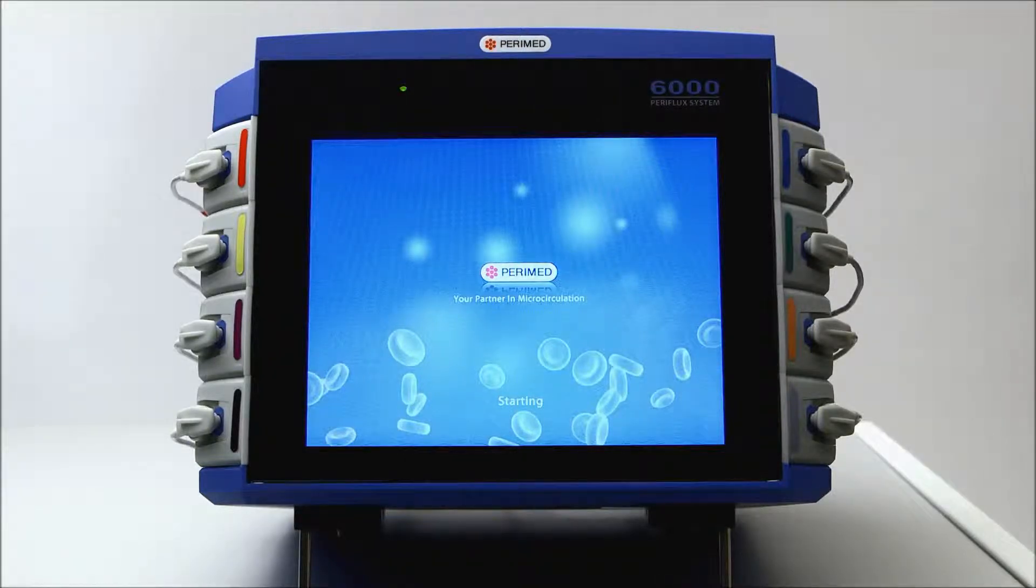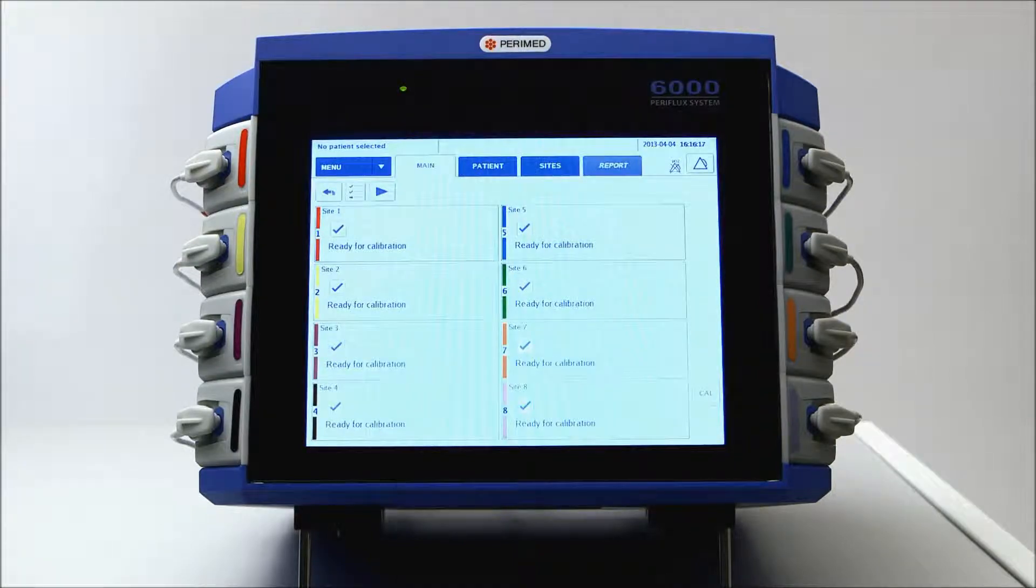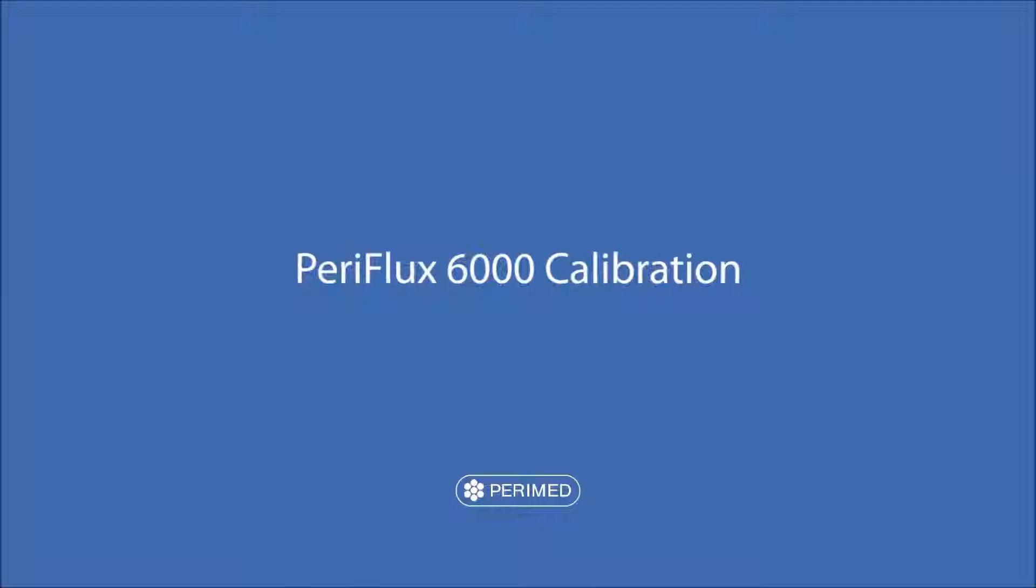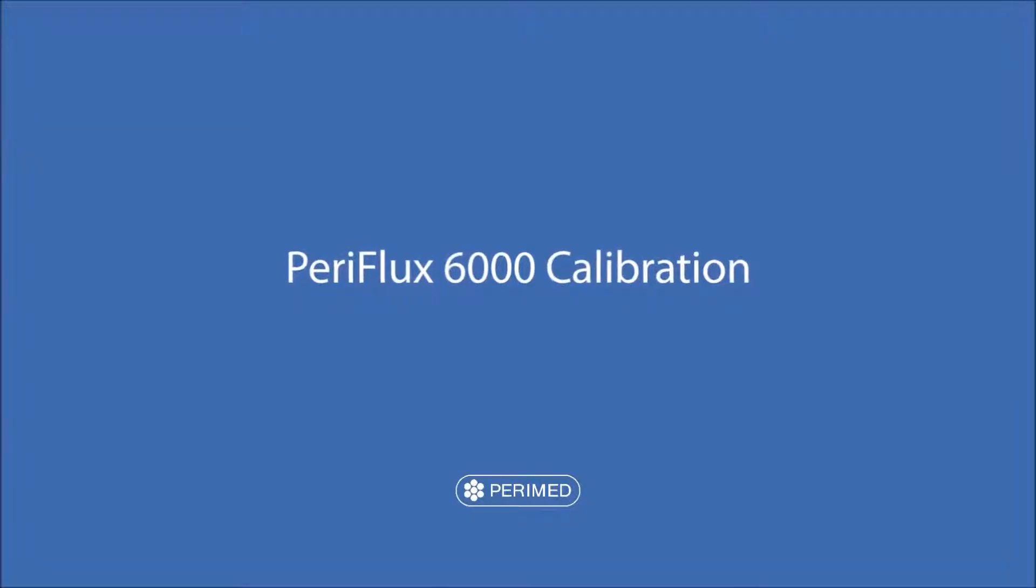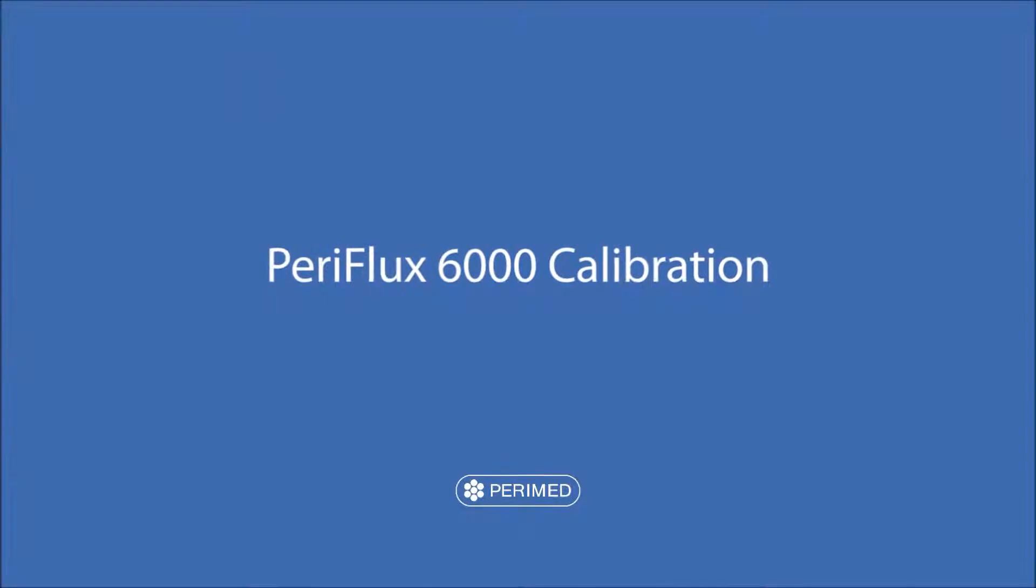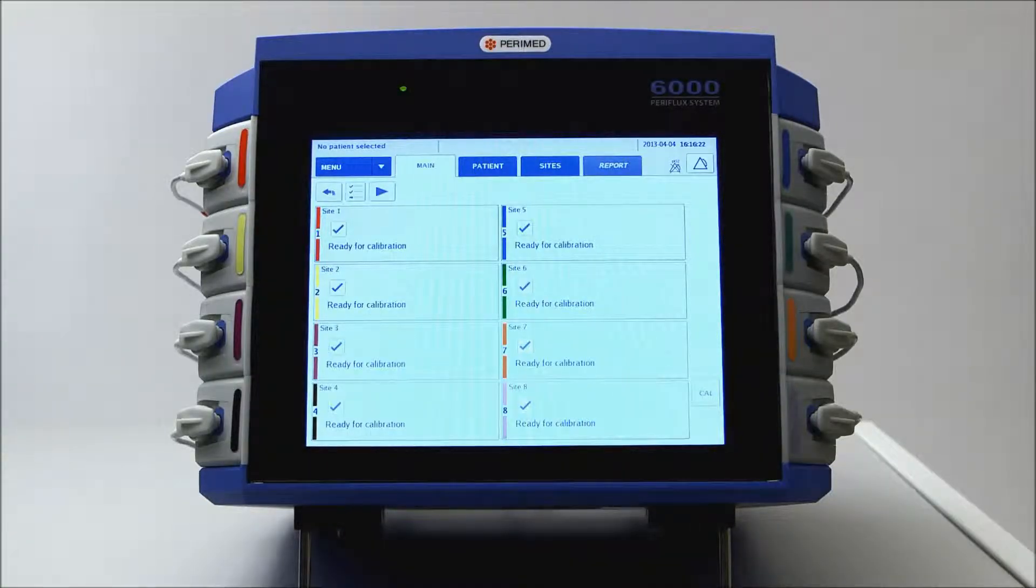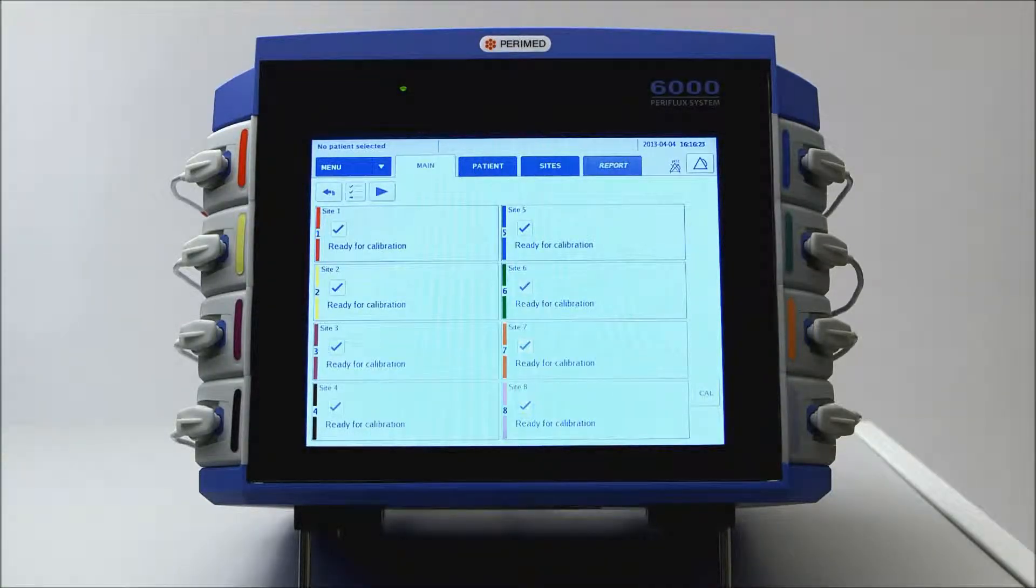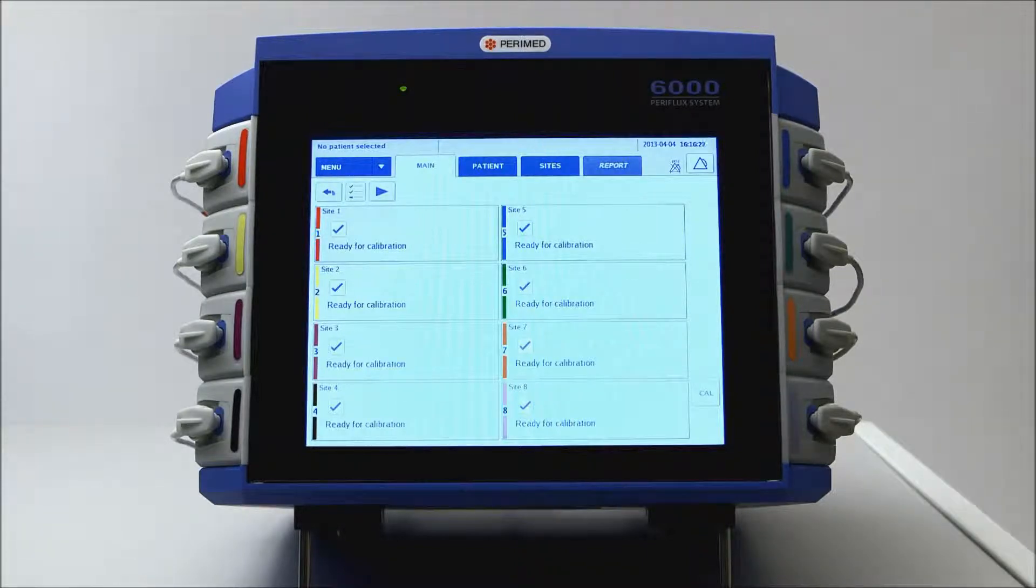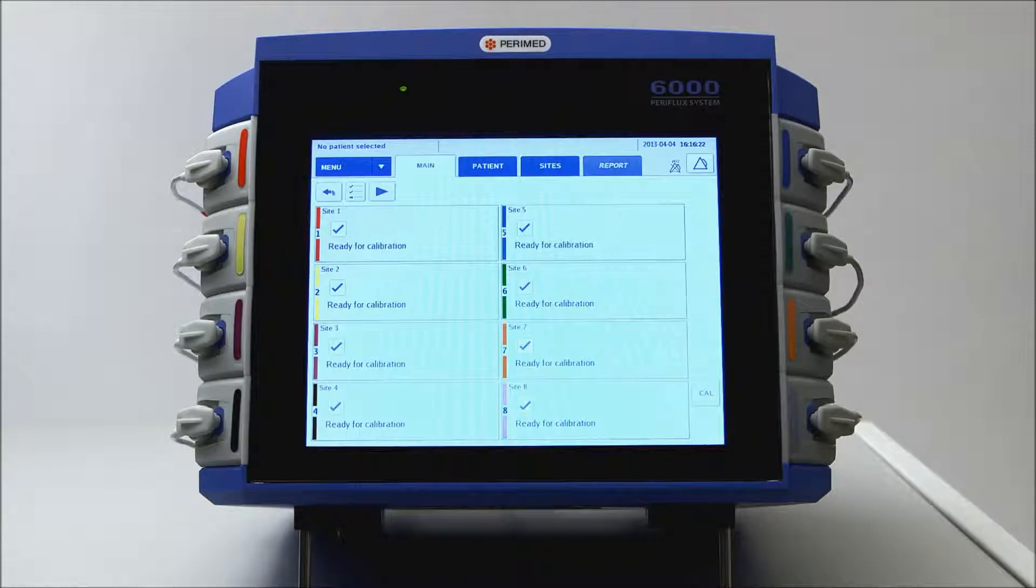It's now time to calibrate the instrument. Before calibrating, the electrode temperature should reach 45 degrees Celsius. You can always check the current temperature on the screen. Lower temperatures can be used.